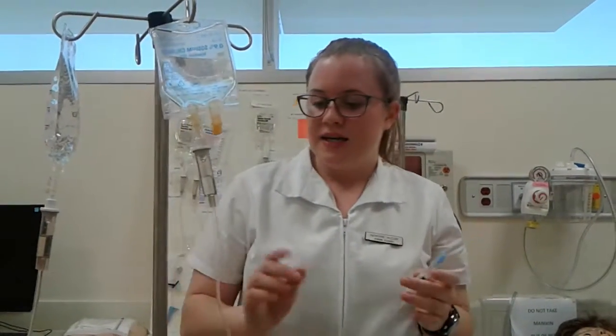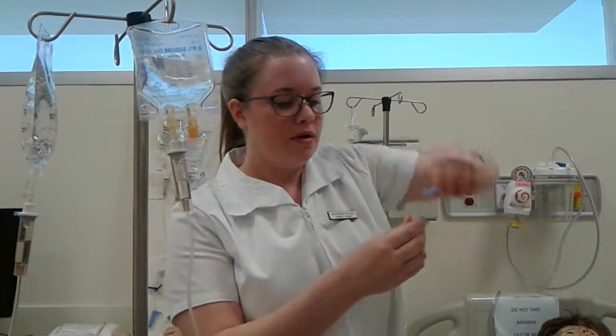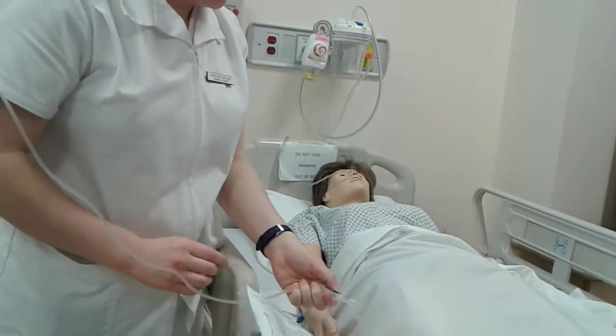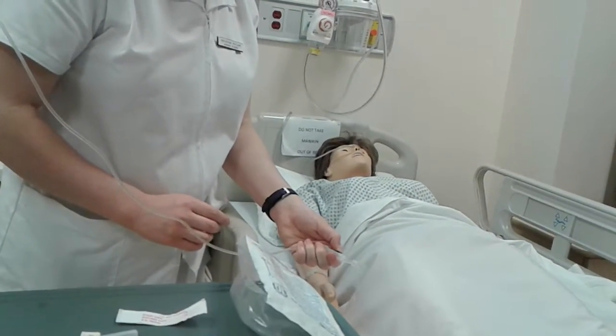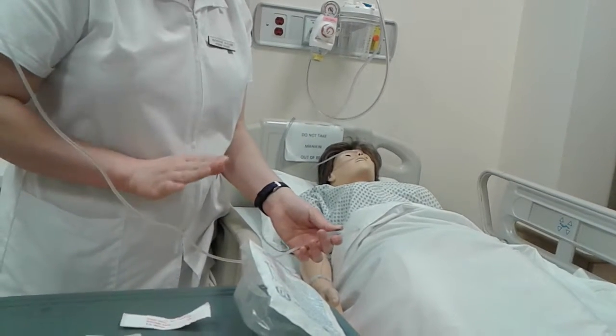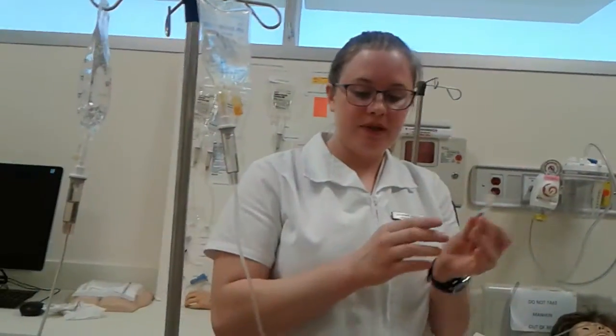Next, I need to prime the IV tubing. So I'm going to remove my cap and open my IV tubing and clamp it while keeping it above waist at all times to maintain sterility. So I have my IV piggyback tubing clamped.